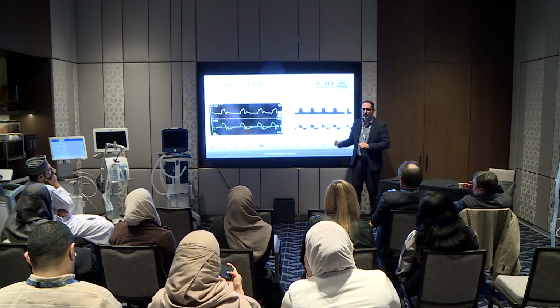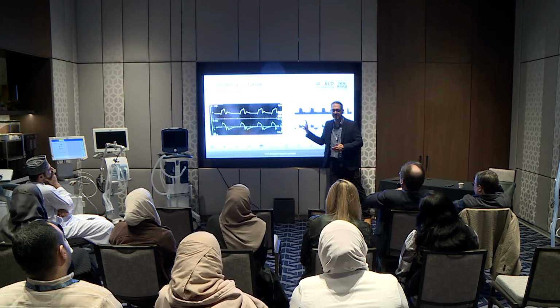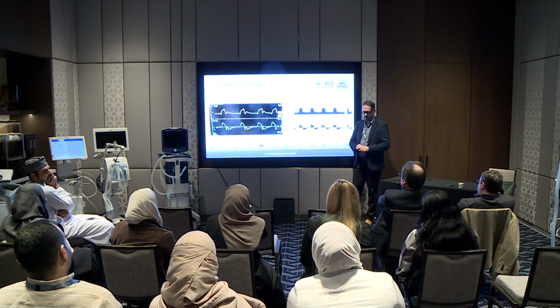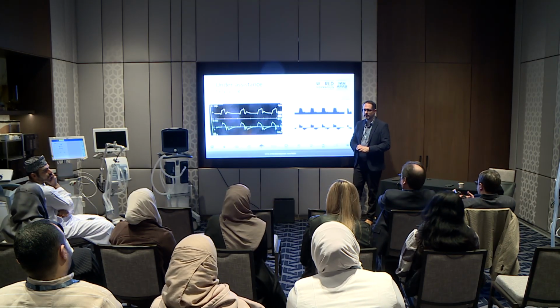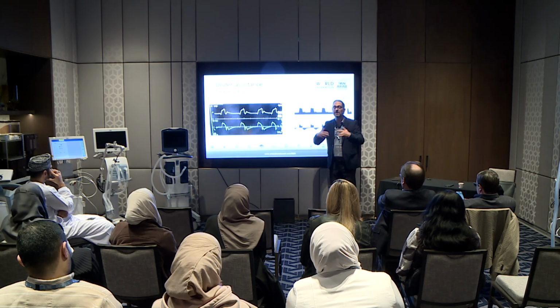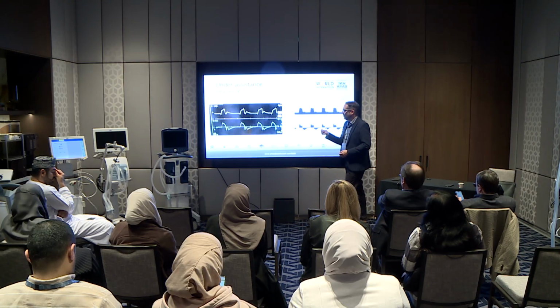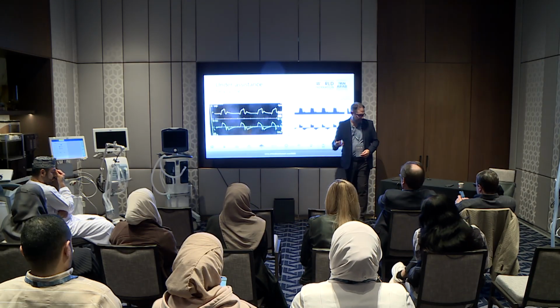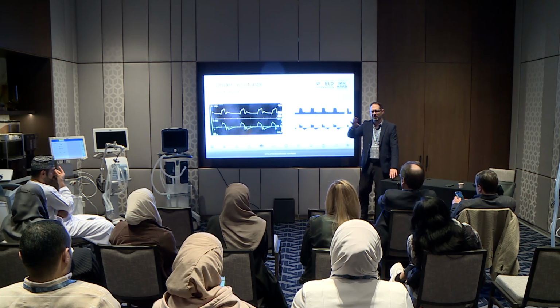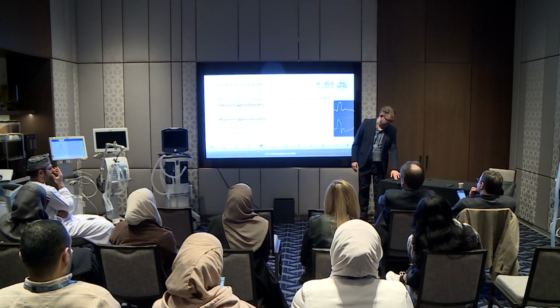Okay, so both of these are what we now call post-inspiratory loading, but two completely different mechanisms. The difference is here the patient is triggering, here it is not the patient. Correct, reverse triggering. Both of them, the clinical consequence is you have post-inspiratory loading. Whether or not this is harmful, we actually have some data. I'll be talking about it tomorrow, or whenever I'm talking about asynchrony. It might be on the 3rd, and I'll talk about it then.